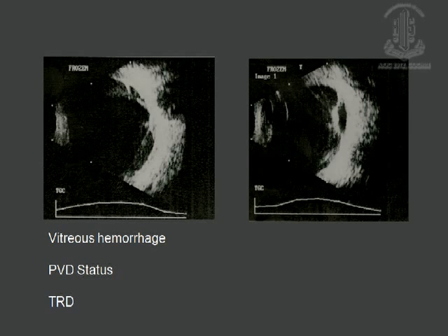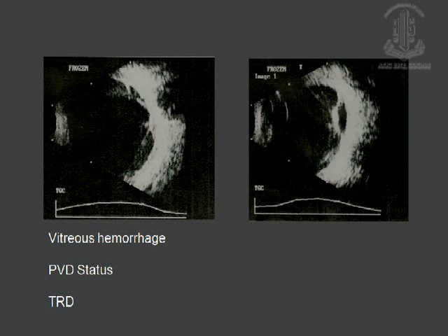Diabetic retinopathy, this will be a repetition of most of what we said. We see PVDs, we see multiple points of attachment in most cases of diabetic retinopathy. You can see tractional detachments posteriorly, you can see splitting of the vitreous cortex, we call that vitreous schisis. Look at the periphery also, most of these cases will have peripheral TRDs.